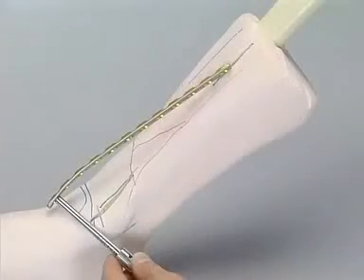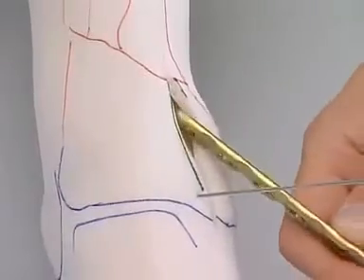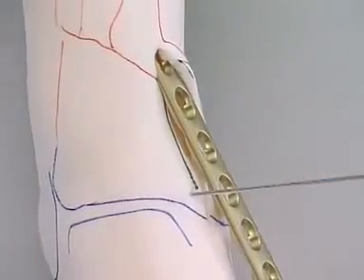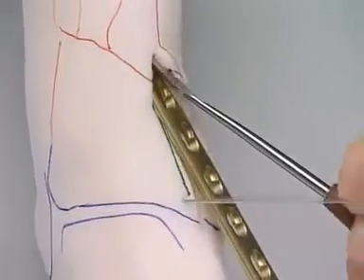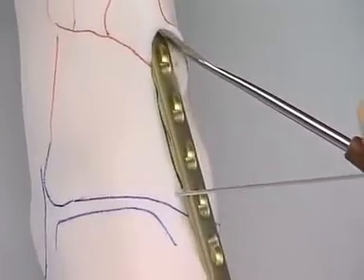A threaded LCP drill guide placed on the distal end of the plate is ideal as a guiding instrument for pushing in the plate in the distal to proximal direction. Depending on the situation, a tunnel first may need to be created with a blunt instrument.